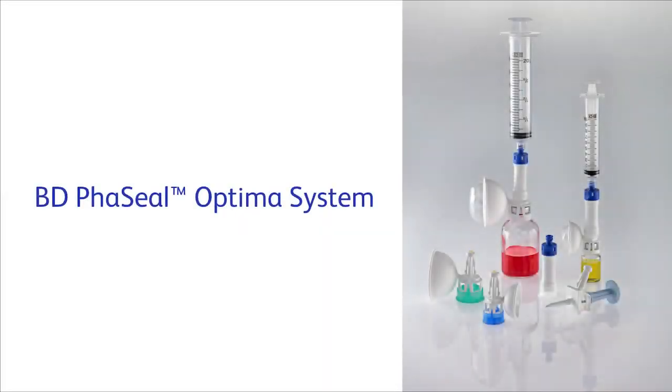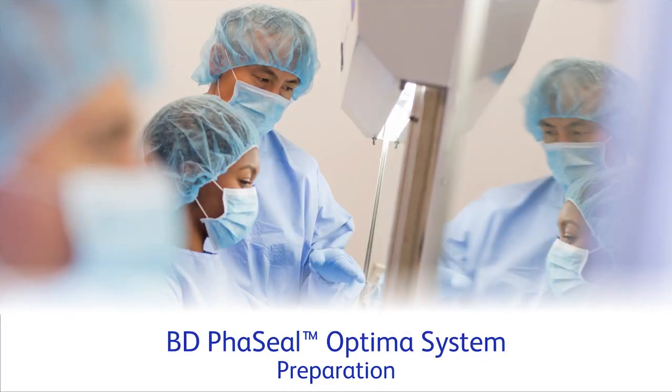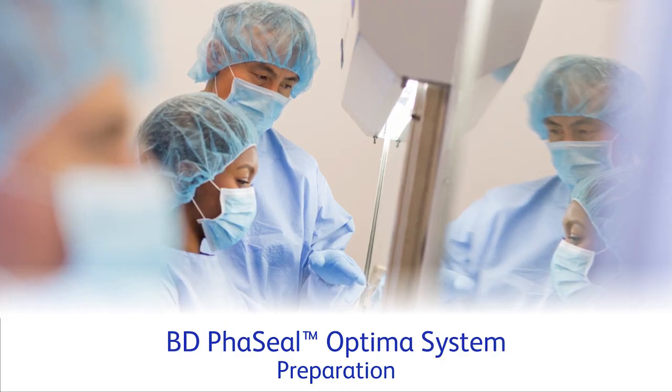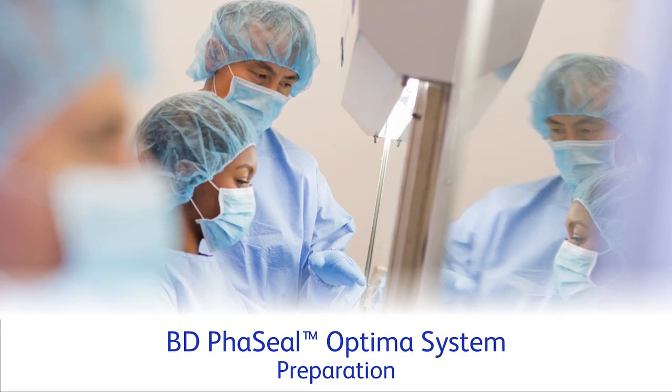The BD PhaSeal Optima System. This video is intended to be a supplement to the BD PhaSeal Optima System instructions for use. Please consult the instructions for use before using the system. The following video describes how to prepare hazardous drugs using the BD PhaSeal Optima System. The video is not intended as a substitute for local guidelines, regulations, or your facility's policies. Always follow standards of practice and facility policy for sterile compounding.